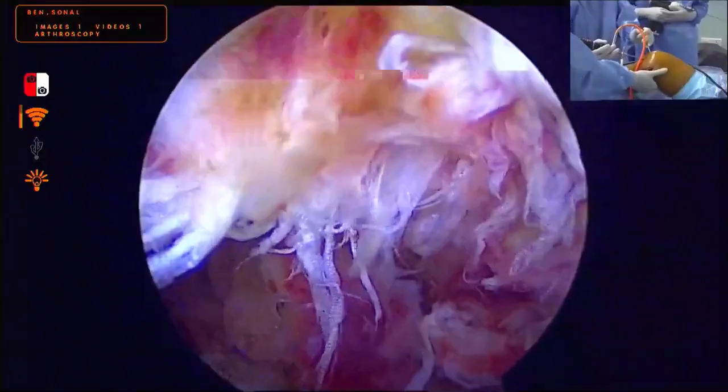Take the cannula a little back. Keep holding the cannula. Hold this. It is getting stuck somewhere. Okay, done. Now insert, load it. Now this is my LR anchor and I am loading the LR anchor.